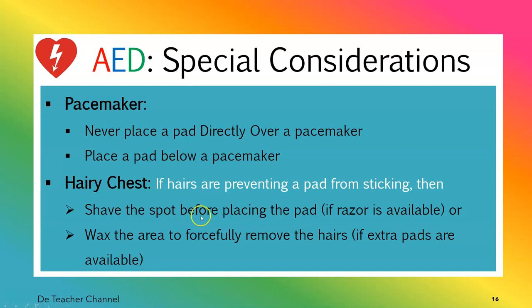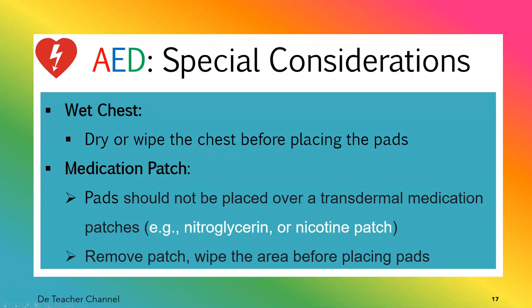Or if you don't have a razor but you have an extra pad, you can wax the area, which means you can forcefully pull the hairs off and then use new pads. Okay, so this is what you do in a case where the chest is hairy.